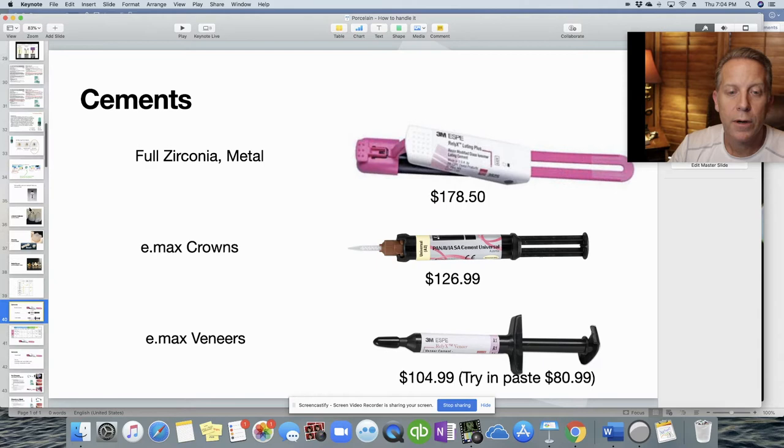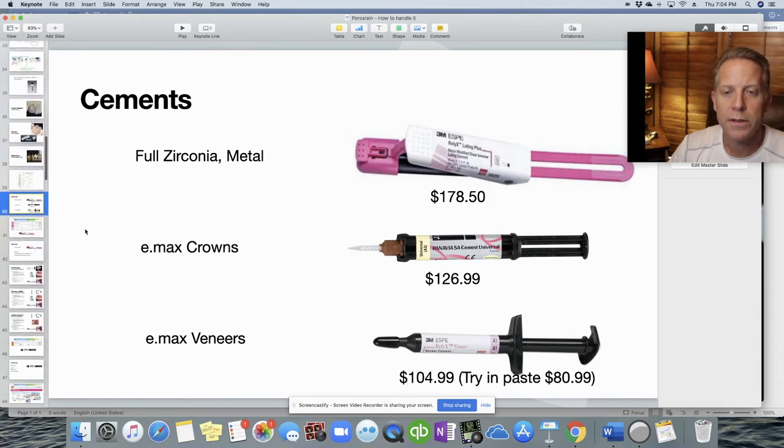Here are the three cements we use in our office. First is Relyx Luting Plus by 3M — we use it on full zirconia or metal. Then there's Panavia SA Cement, which we use on Emax crowns. And then 3M's Relyx Veneer Cement for veneers — whether Emax veneers or feldspathic, any kind of veneer is going to use this cement.